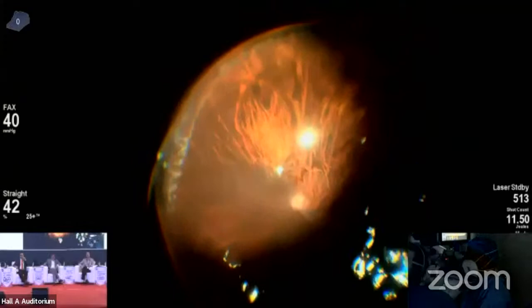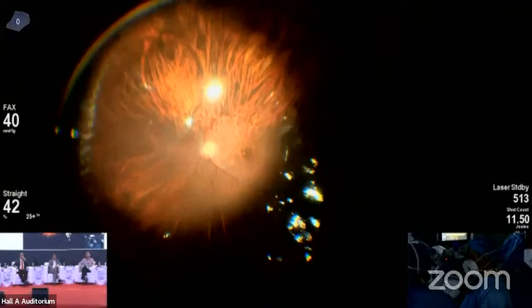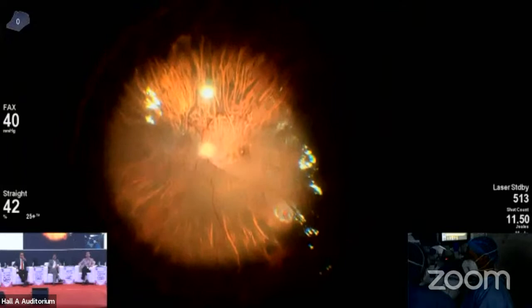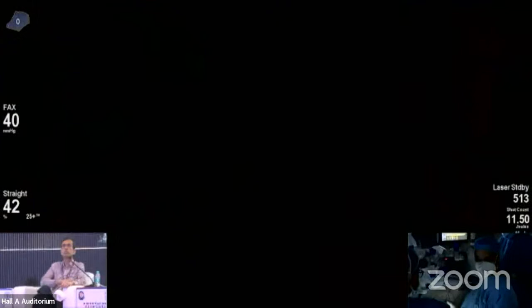So now we can go and inject this patient with tamponade. I think there's no need to inject oil in this case. We can go ahead with the SF6 gas. So this is a fresh detachment with no PVR, a single tear in the temporal quadrant. A gas should suffice in such cases. So we'll do it the conventional way.